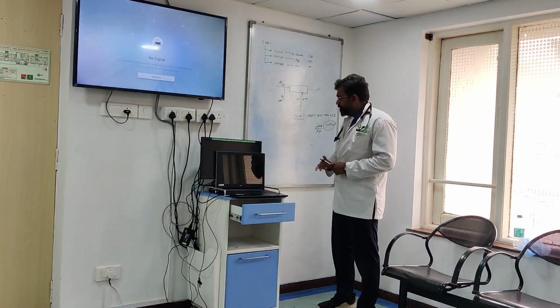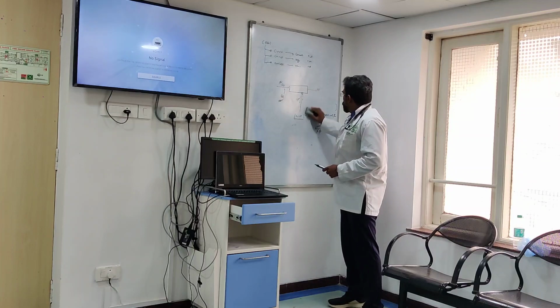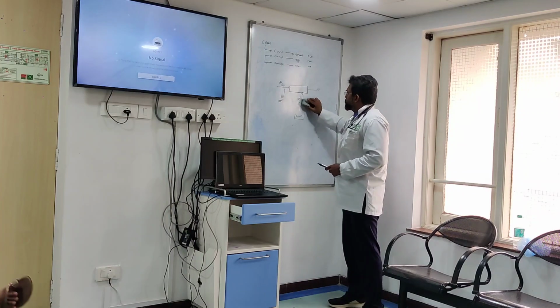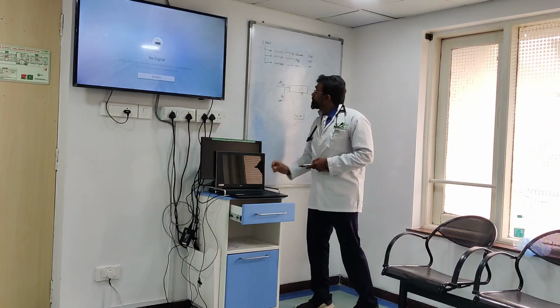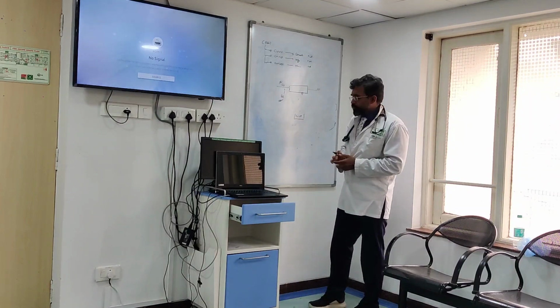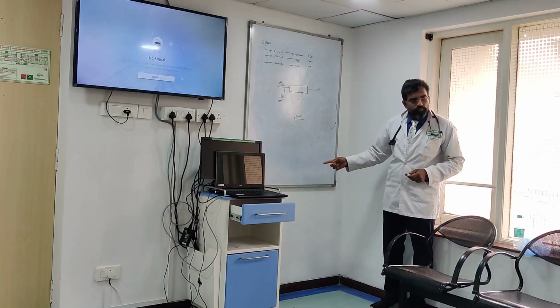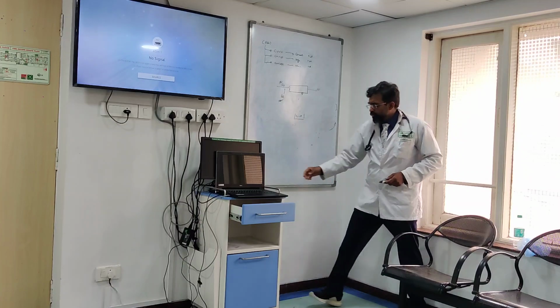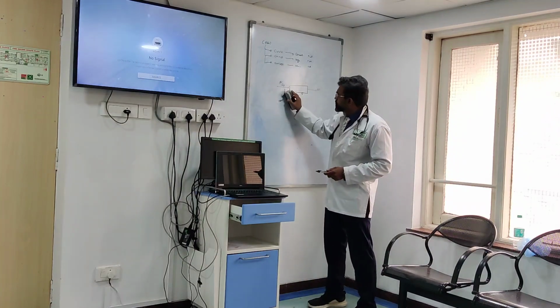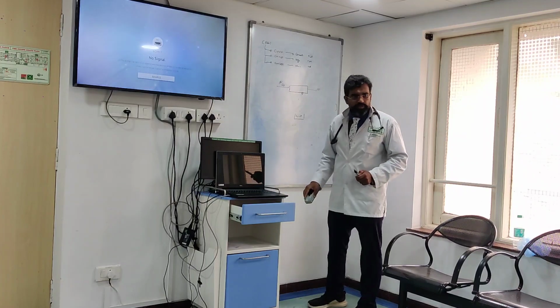Now let me change the modality for you. This was for CVVH. I'm going to change the modality and I'm going to make dialysate. I'm going to add it as CVVHD. So what do I remove from here? Nikhil, come. What do you want to remove from here? Replacement fluid. Remove. So I'll do it for you. He's right. So sit down. I'll remove my replacement fluid.